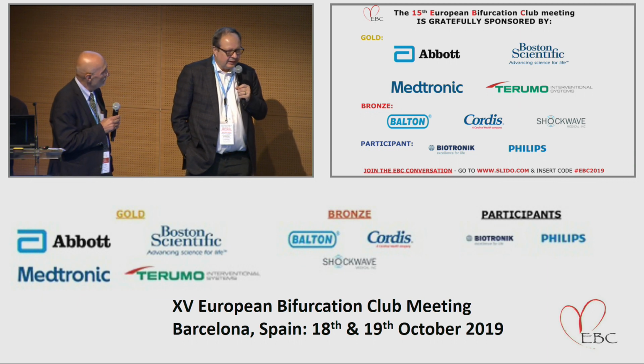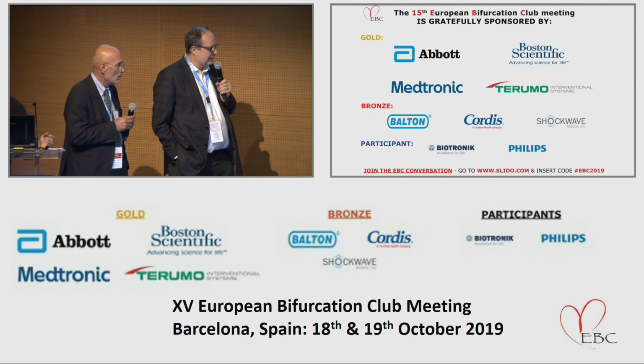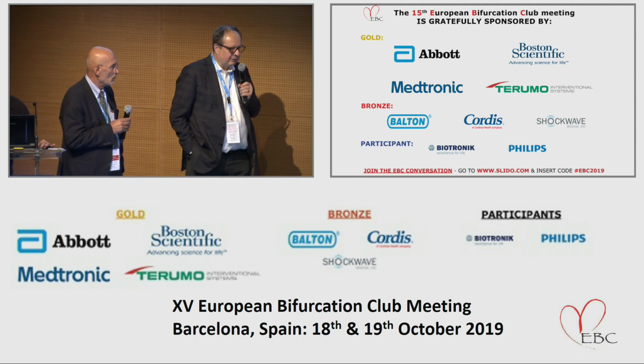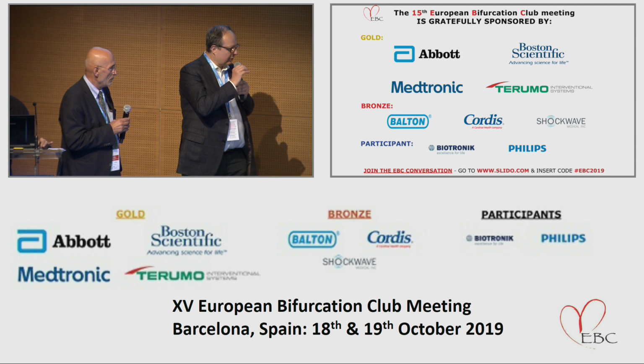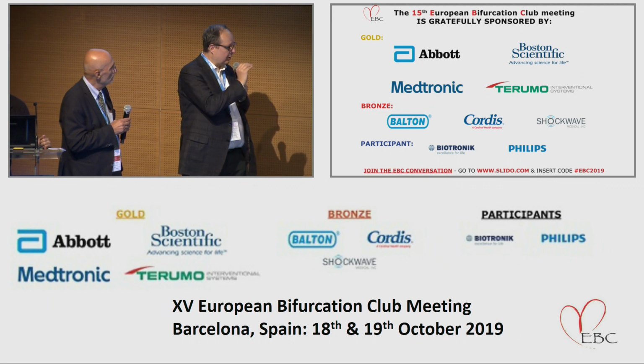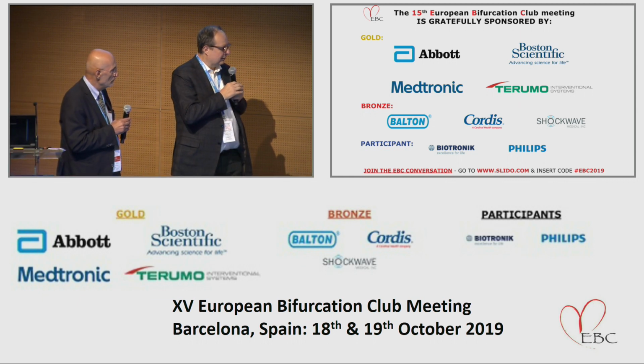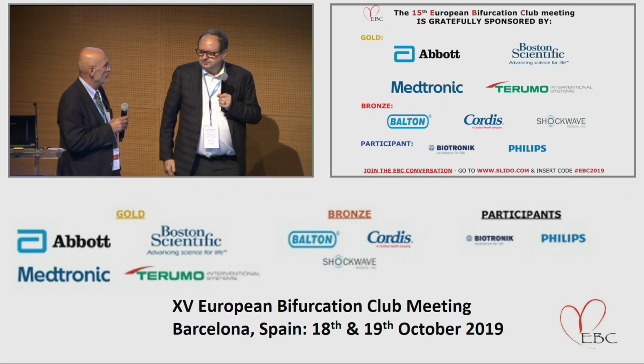So I think the DK crush is a living technique, and we've already changed it, and I am now doing what's called a pot crush. So instead of doing a pot crush and a kiss, if you wish. But this is a recommendation of Shen also to do pot 3 times. Exactly. So it increases the complexity, or rather the length of the procedure. To answer the question, go on.